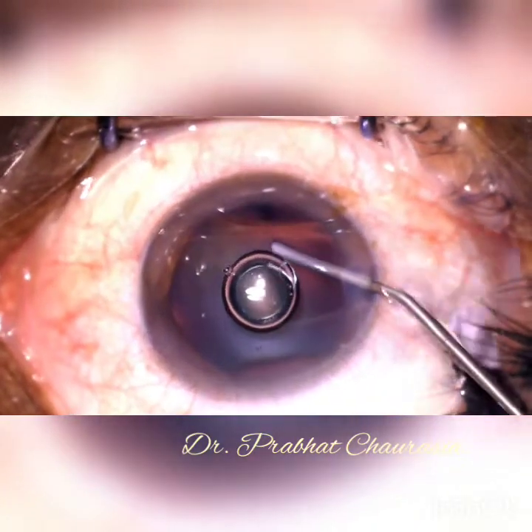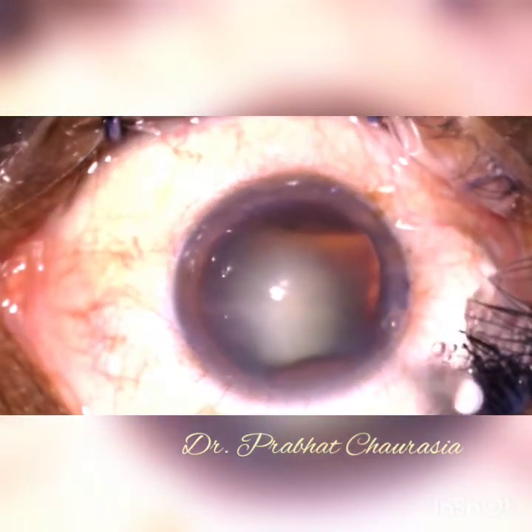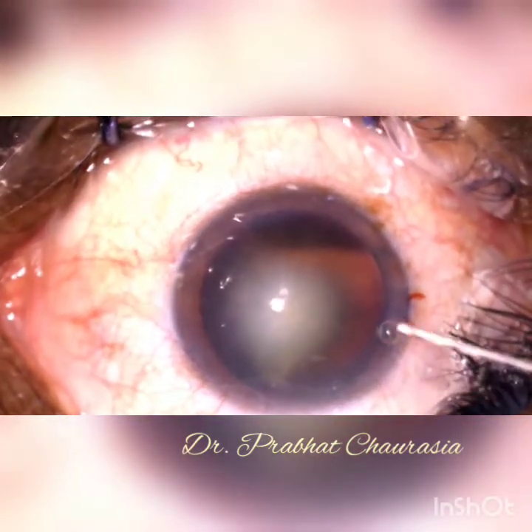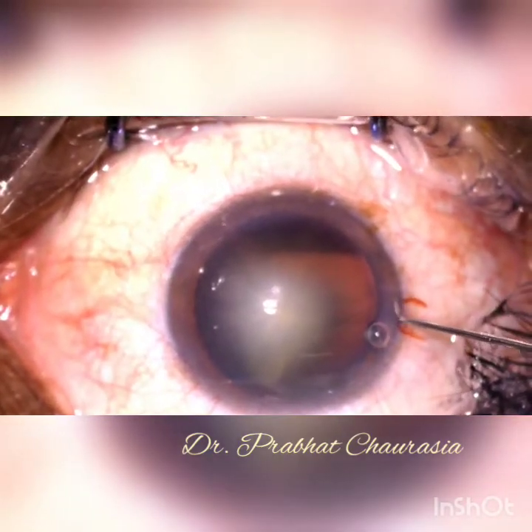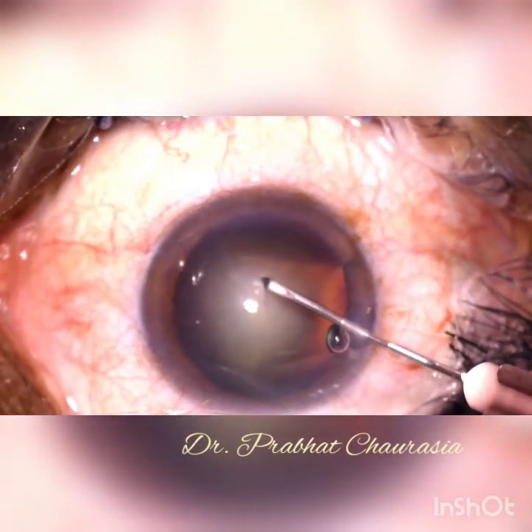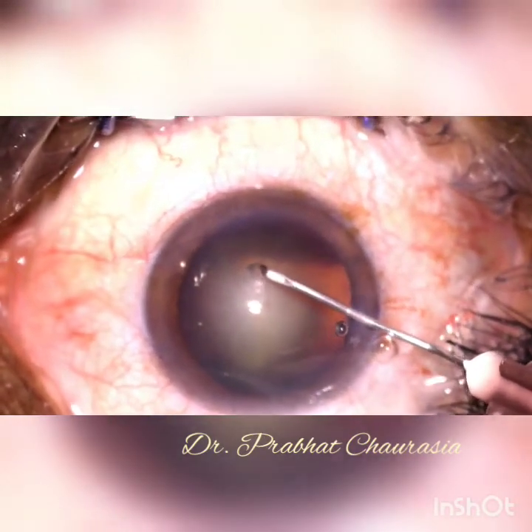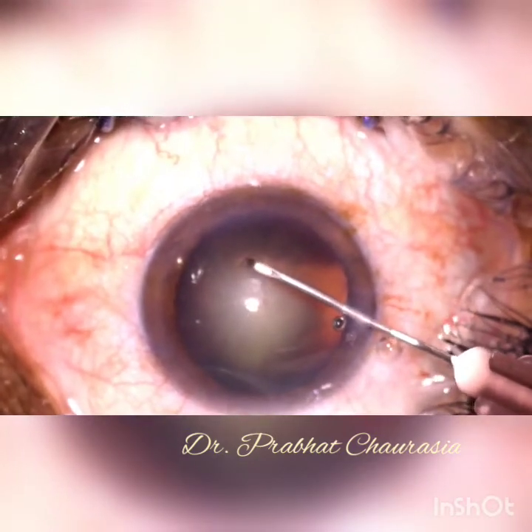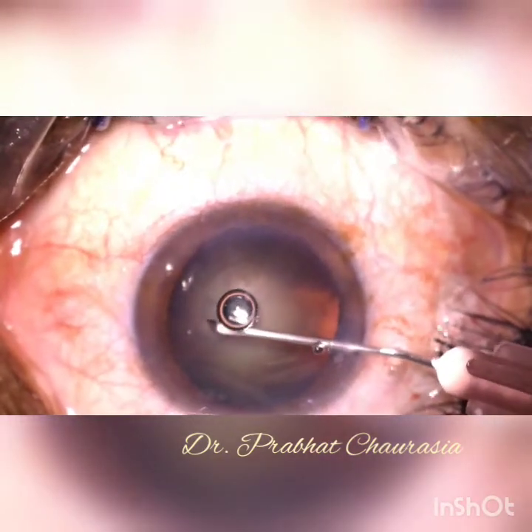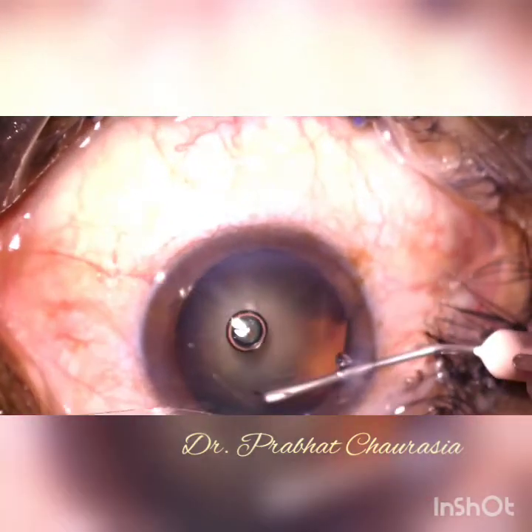Inject 2% HPMC and spread some HPMC over the corneal surface so as to enhance the visualization. Now, by using a bent-tip cystitome of 26 gauge needle, I am starting the rhexis.